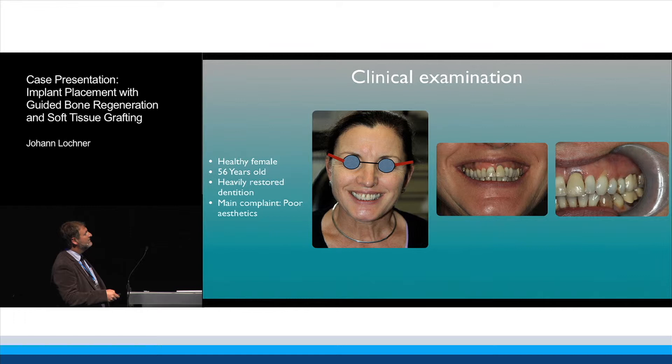Over here. Recession on the canine, and also a dark triangle between the two front teeth.